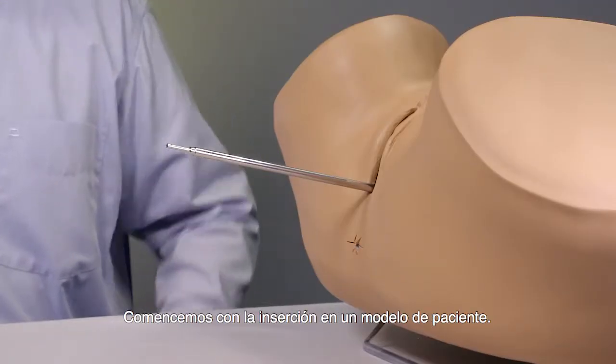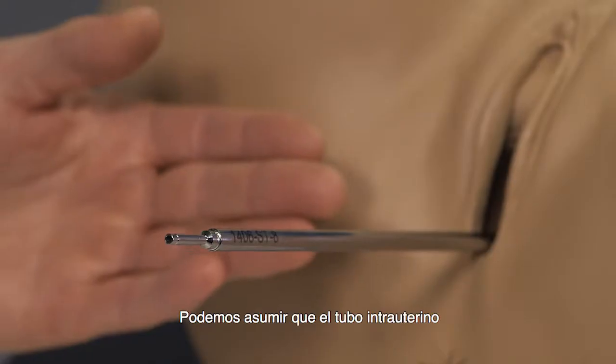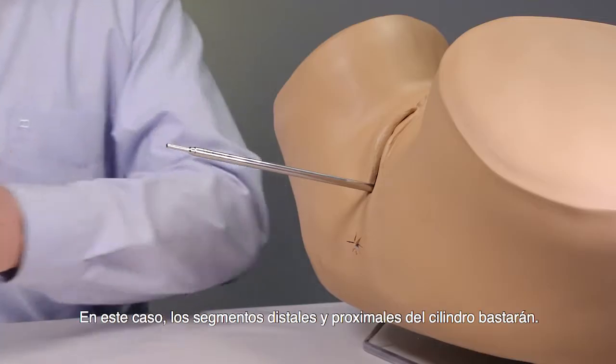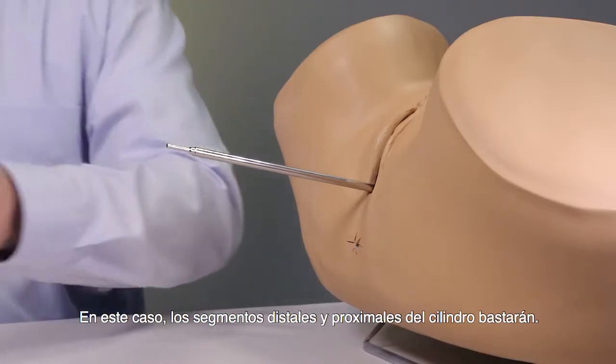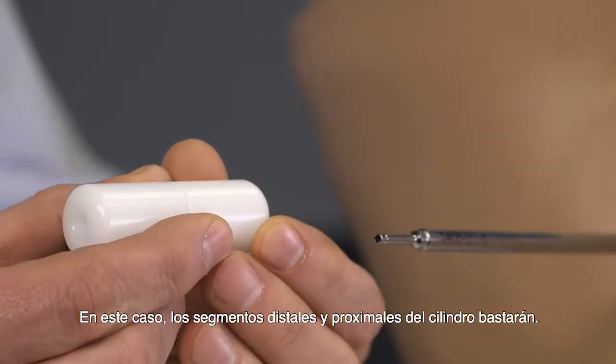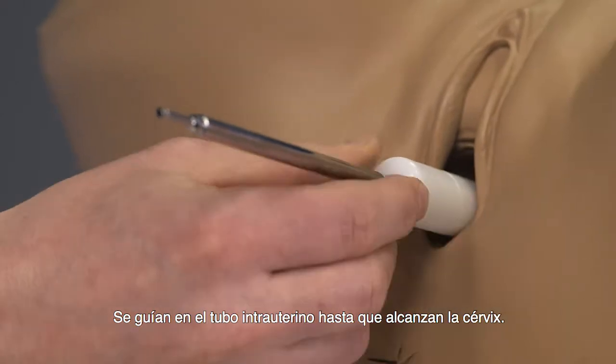Let's begin with the insertion using a patient model. We can assume the intrauterine tube with the integrated cervical stop is already implanted. In this case, the distal and proximal cylinder segments are sufficient. They are guided over the intrauterine tube until they reach the cervix.